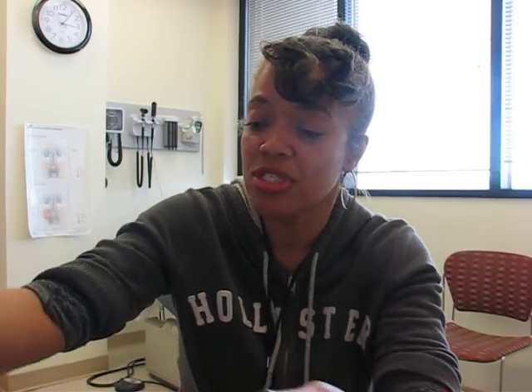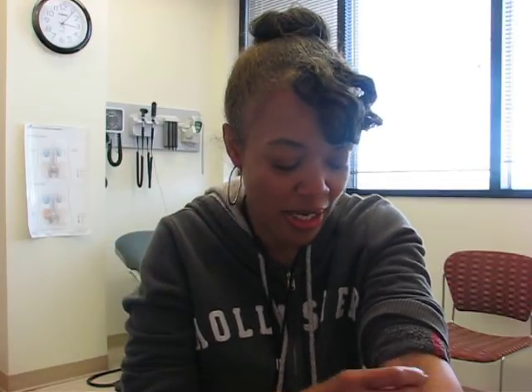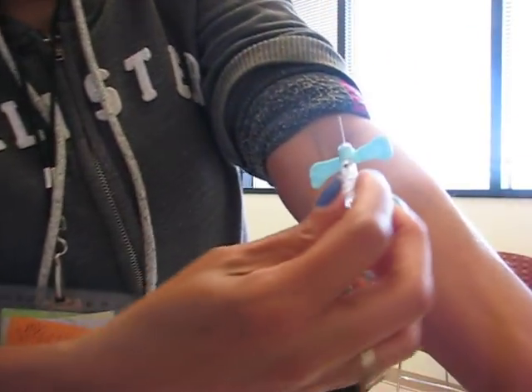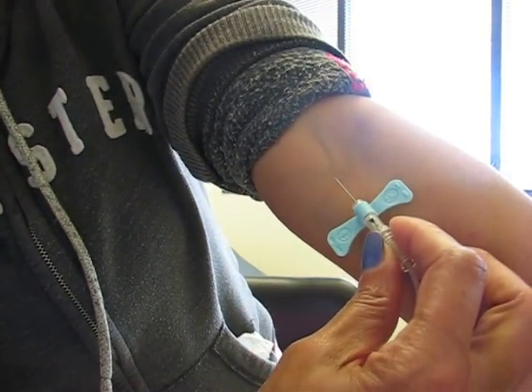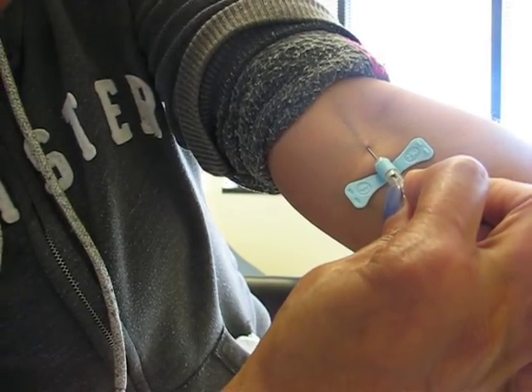Let's see how this works. Although I'm not a hard stick, I want to tell you guys something about doing this and why I recommend that you try a straight needle first. You've got to think about it — just think about a hard stick. This is a hard stick, let's say this is a hard stick. We get in the vein right about here. This is a 23 gauge butterfly. We have no flash. This is all hypothetical — we have no flash.